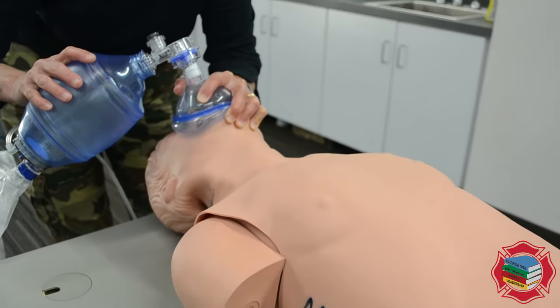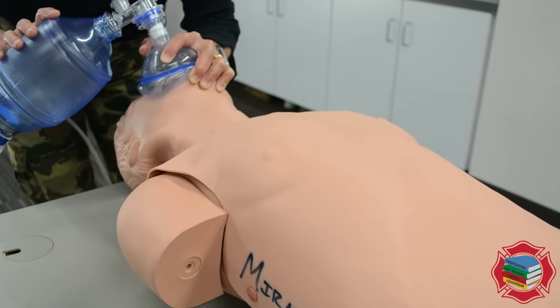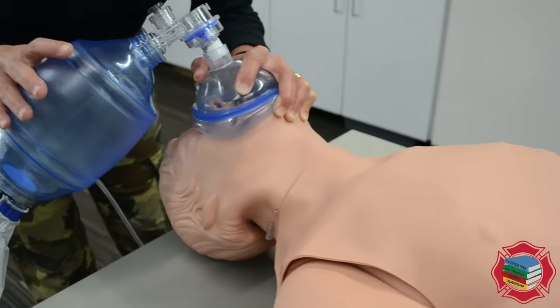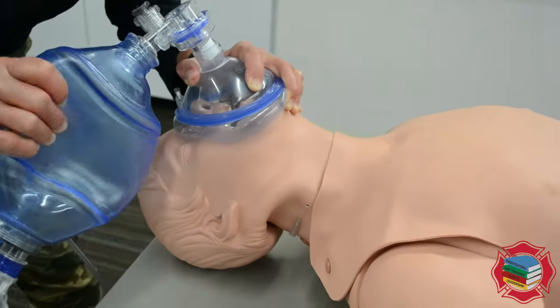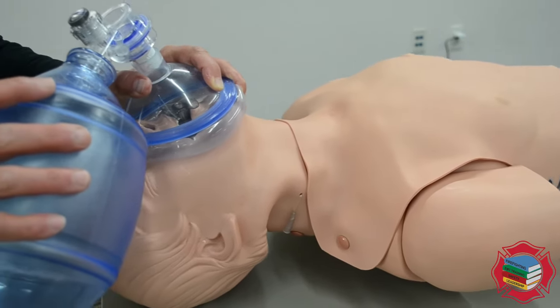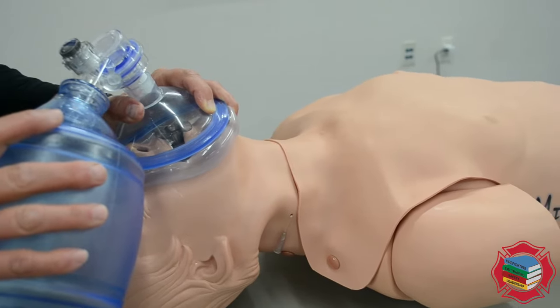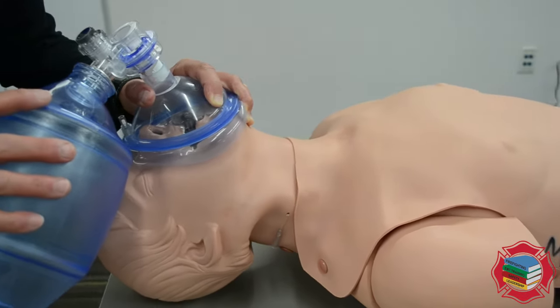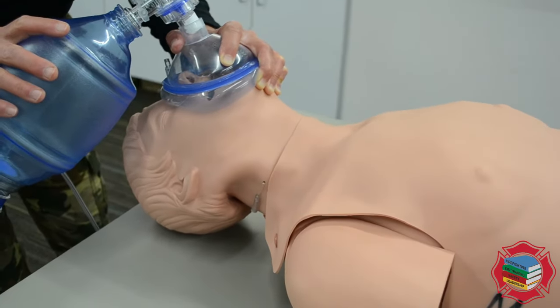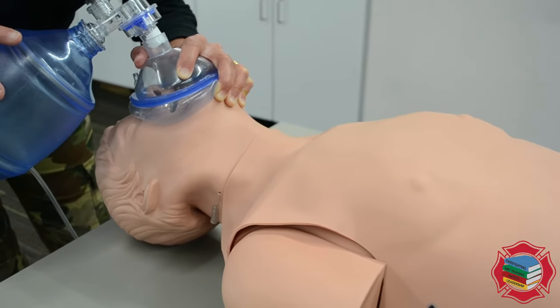I'm basically looking for chest rise. When ventilating an adult patient who has a pulse but is not breathing, breaths are delivered one breath every five to six seconds. Typically you'd count: give a ventilation, one one-thousand, two one-thousand, three one-thousand, four one-thousand, five one-thousand, then squeeze.